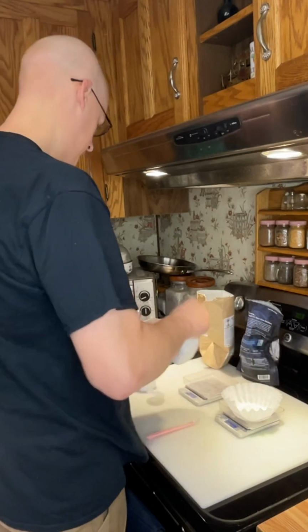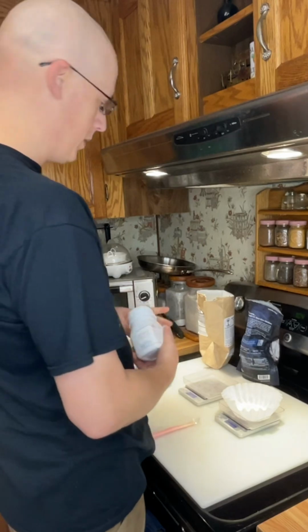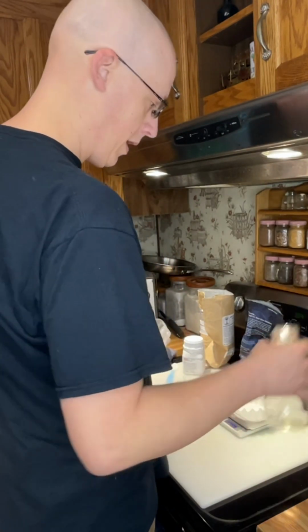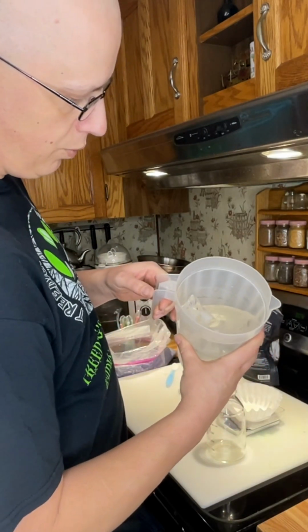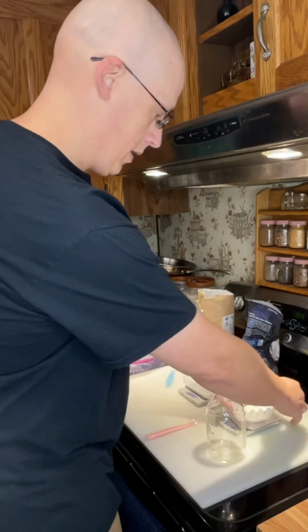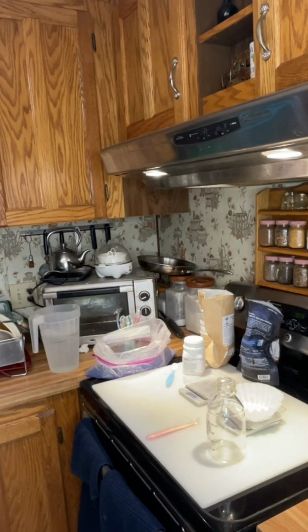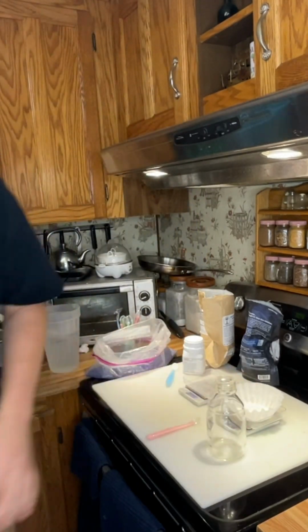All right. So the secret to Gellan gum, in my experience, is to use super duper cold water if you're going to mix it in a media bottle. So in this case, I have actual water with ice in it. This is ice water, cold as hell. I'm going to have it all ready here. I need a ring, however. Throw our ring on there.